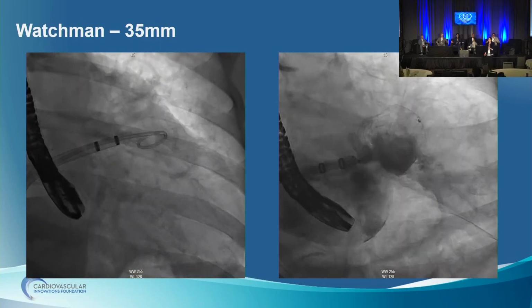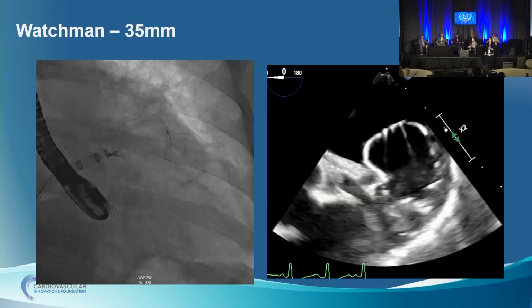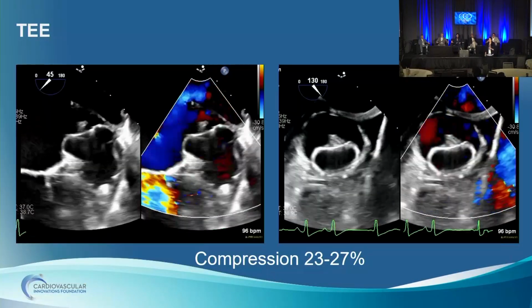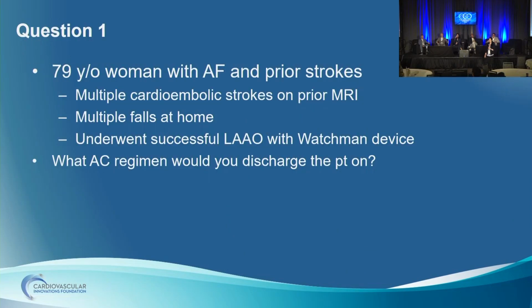You can see on the angiogram that we don't have any leak there. We did an adequate tug test here. The device is stable, and so this device was deployed. We also, obviously, looked for leaks and compression, and that was fine.